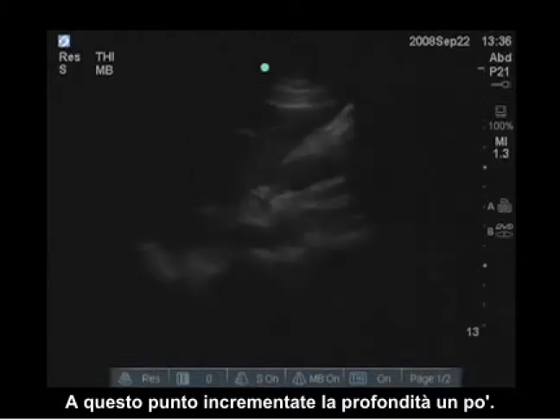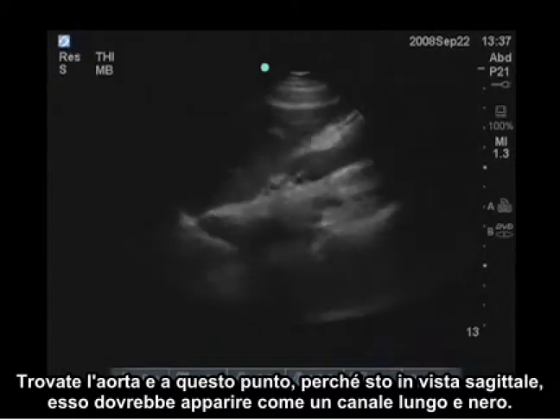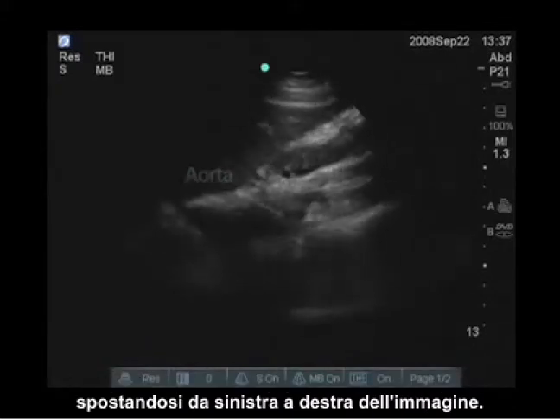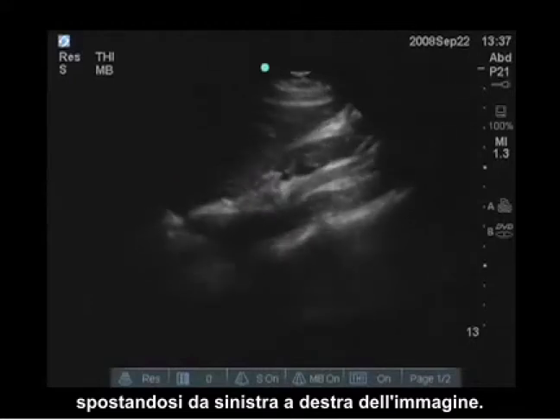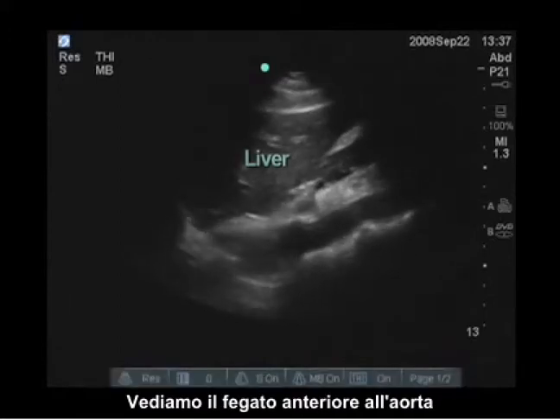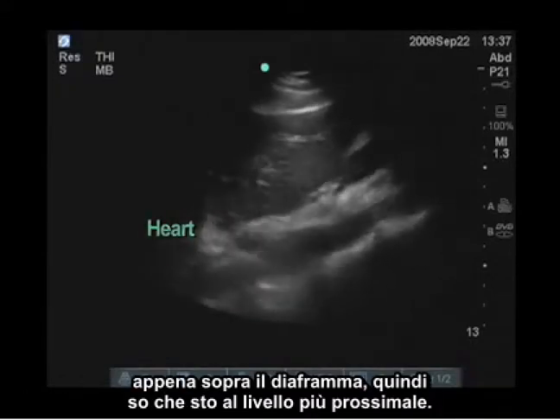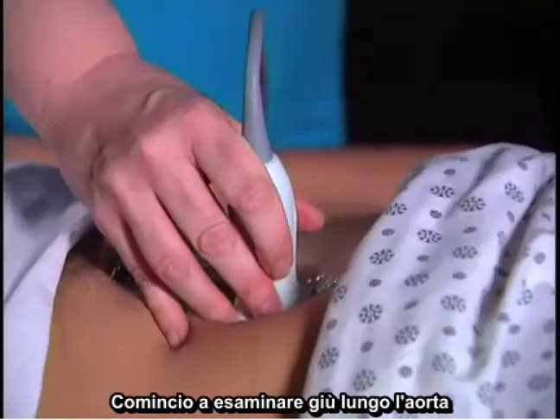I'm going to increase the depth here a little bit. Find the aorta, and at this point, because I'm in a sagittal view, it should appear as a long black tube moving from the left to the right of the image. We can see here in the image I'm in the very proximal portion of the aorta. We see the liver anterior to the aorta. I move up a little bit, I can see the heart beating just above the diaphragm. So I know I'm at the very proximal level, and I'm going to just start to survey down the aorta.